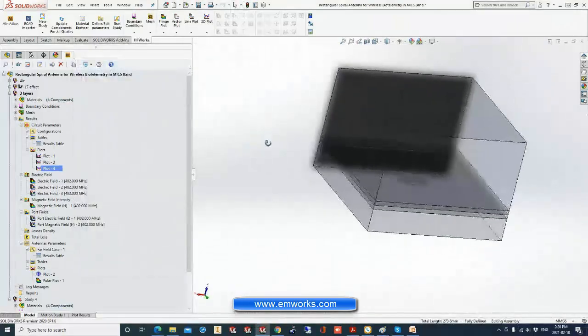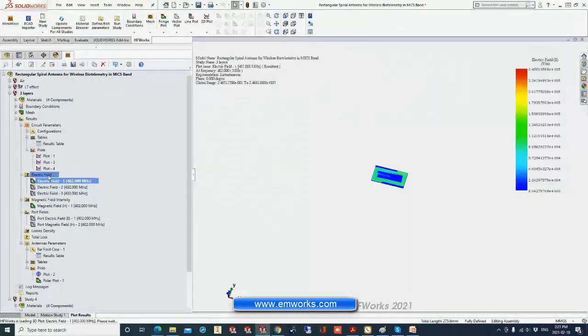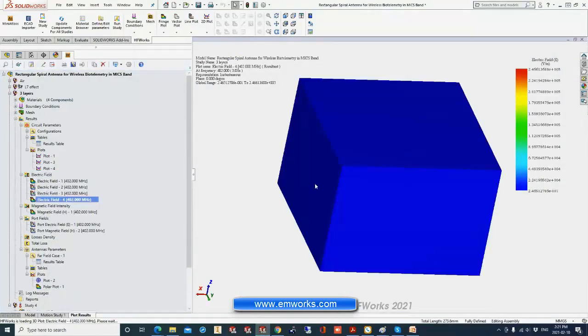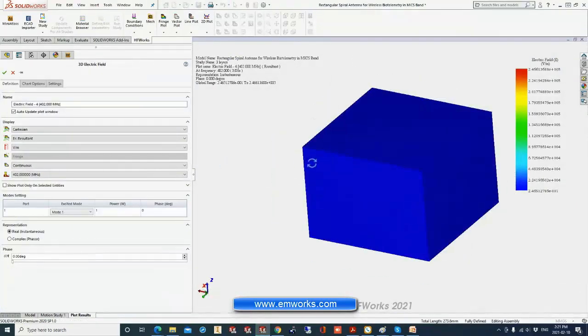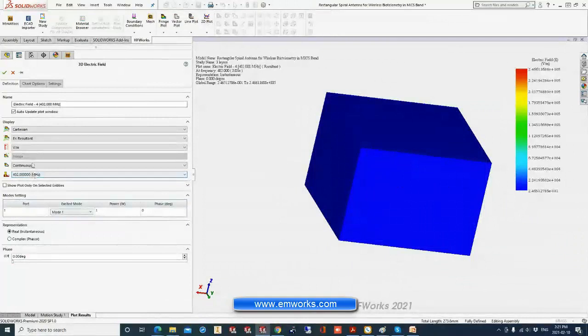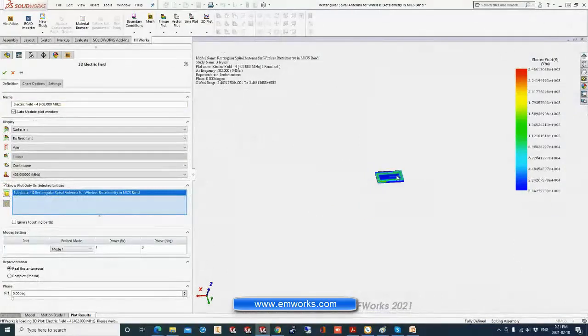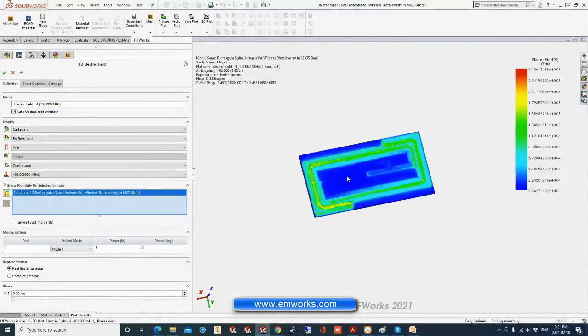We can also plot the electric field. This is the electric field on the whole body. It's normal to get a blue color outside because everything is inside the computation domain. But to see inside, we can show it on a particular part, and we can pick the part from the SOLIDWORKS tree here, on the substrate, only on the substrate. For example, I don't care about the other bodies. So this is the electric field really in the substrate.